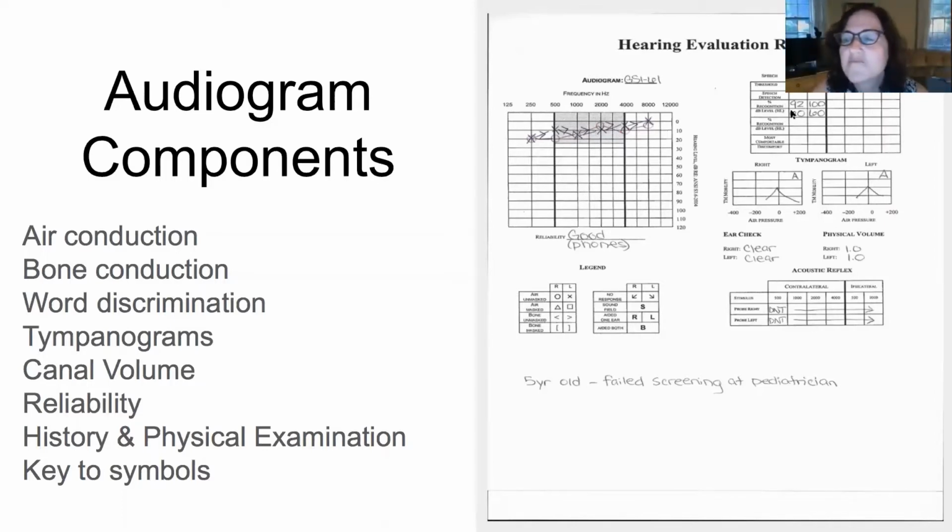And you're going to go 40 decibels above. So it should be really, really easy to understand for people. And you're going to give them these phonetically balanced words. And this is a percentage of the words they get right. Sometimes as people age or for other reasons, people will lose their ability to understand speech. So even when you give it to them loud enough, it's all very garbled. It sounds like blah, blah, blah, blah, and they really have a lot of trouble.